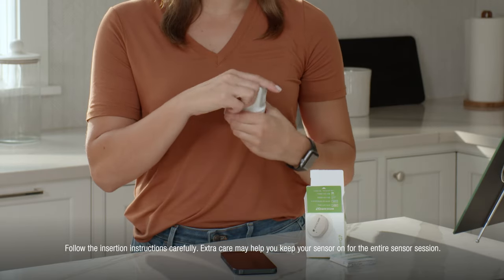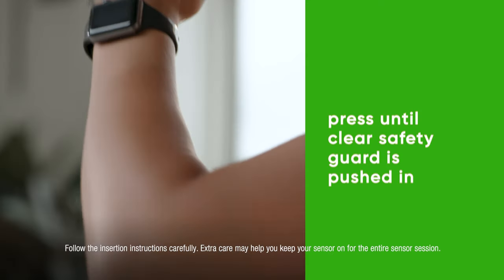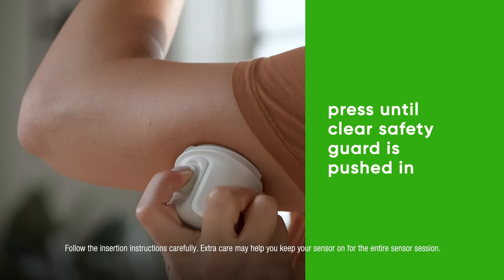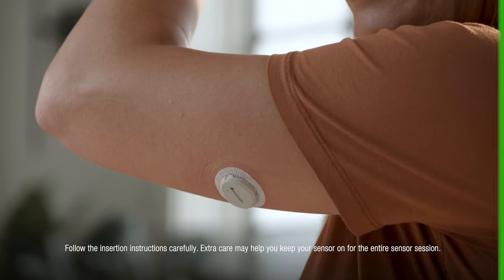Don't touch inside the applicator. Press and hold the applicator firmly against your skin. Now push the button and remove the applicator.